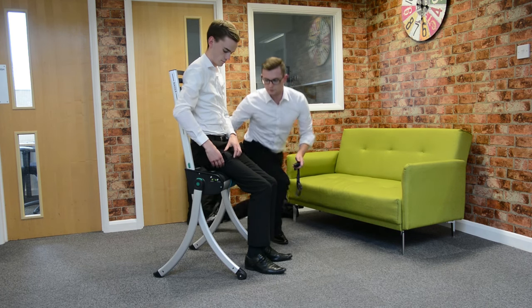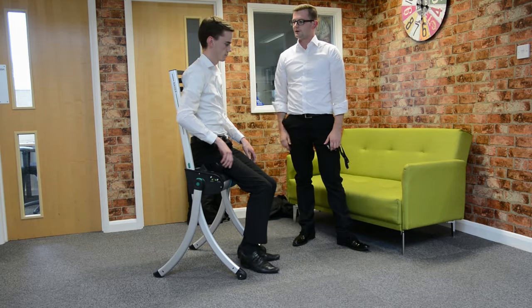There we go. We're in a nice, stable position to mobilise. Off you go.